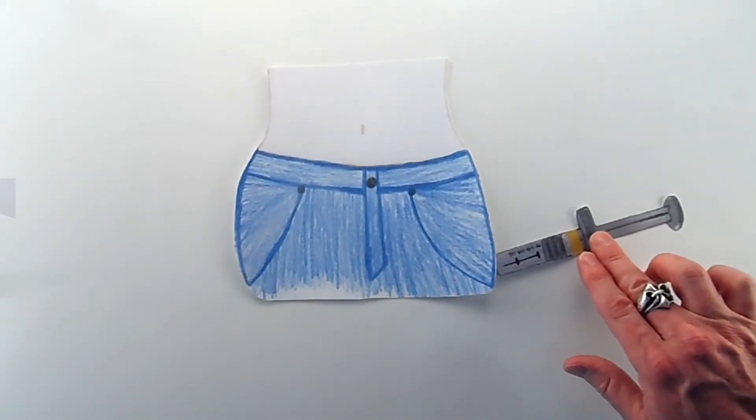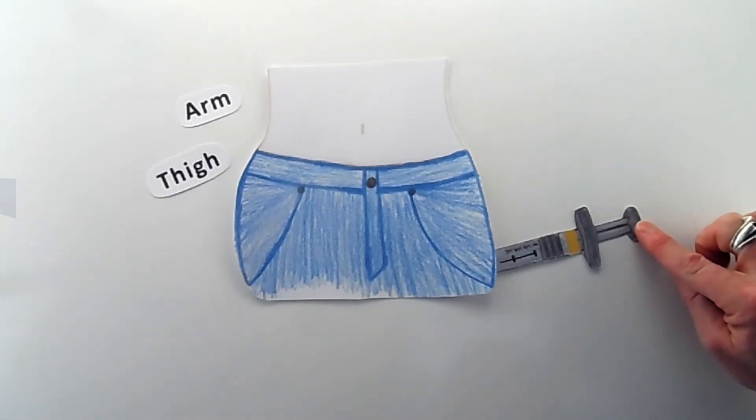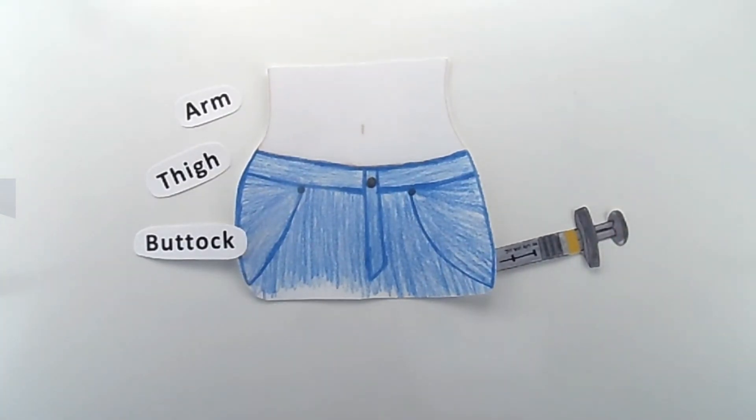Inject the glucagon as quick as possible. The best spots are the arm, thigh, or buttock. At this point, it's important to know that glucagon is not harmful.